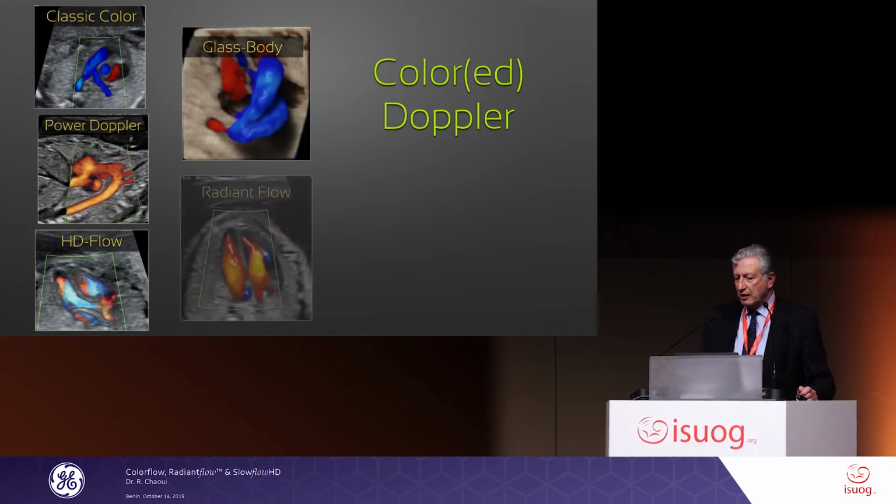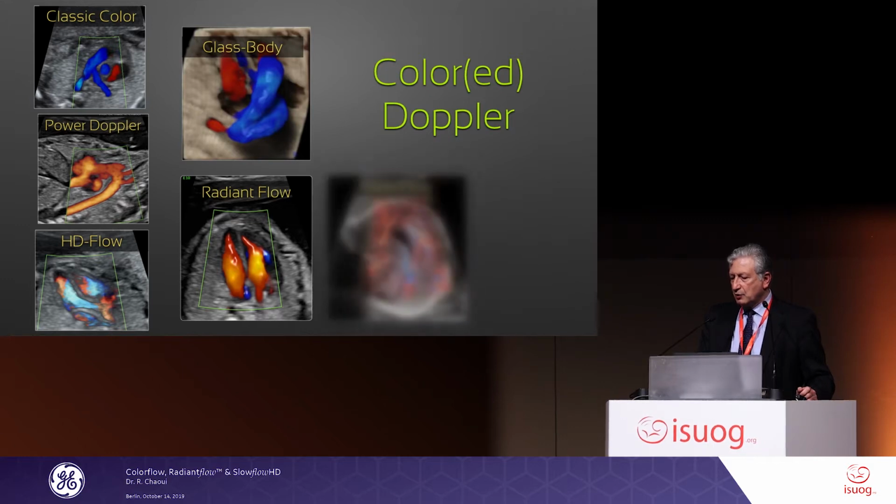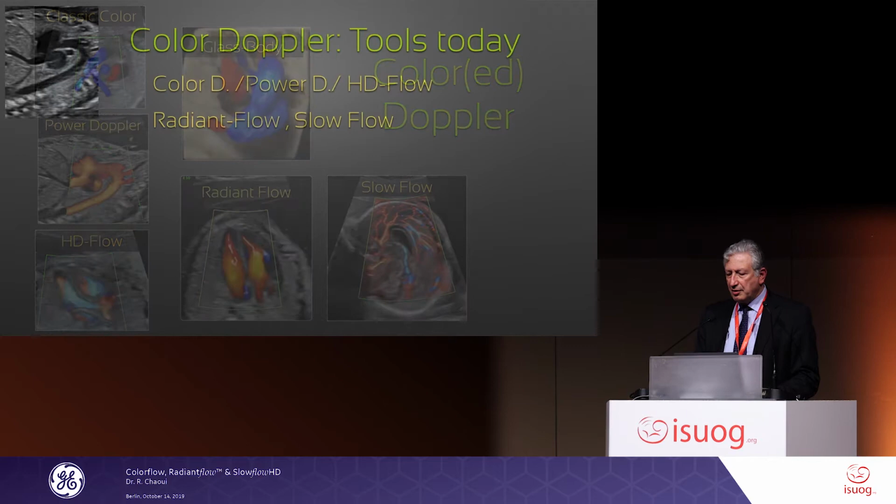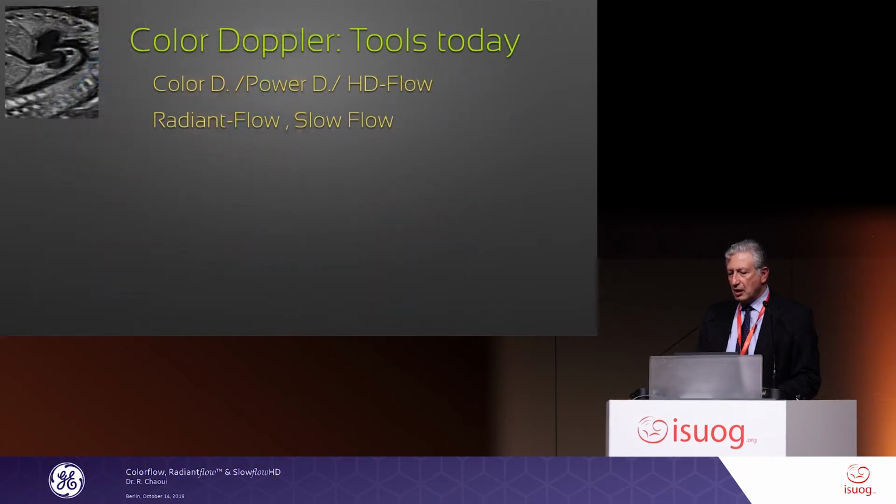And since a few years, we have also the Radiantflow, as well as, since last year, the SlowflowHD technology, allowing us to measure and to demonstrate velocities in the very, very low range. So I'll show you some regions we are using. So this is how we are scanning.